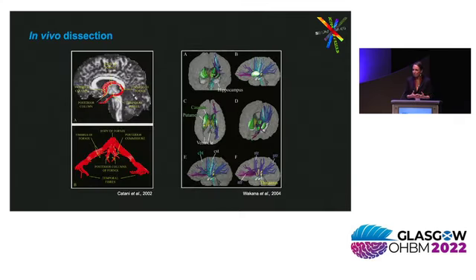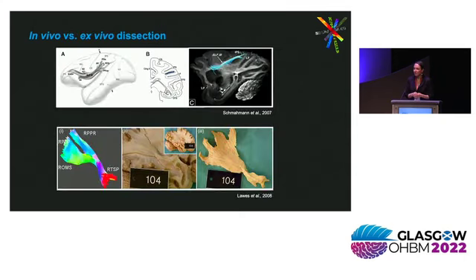The early excitement about tractography came from the first studies that showed that this technique was able to reconstruct known white matter pathways, like the fornix and the thalamic tracts shown here, for the first time from an in vivo MRI scan. Until then, these pathways could only be identified post-mortem, for example, with anatomic tracing in non-human primates or by physically dissecting human post-mortem brains.